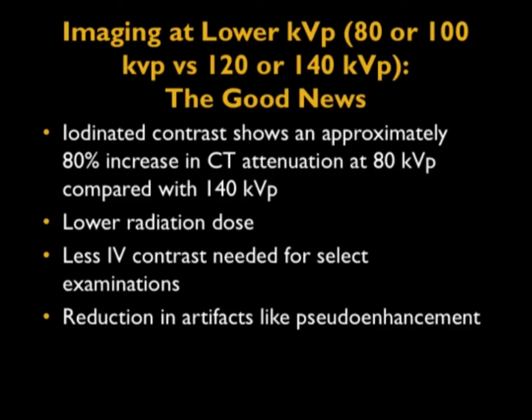You can use less contrast and still get an adequate study because you can make things brighter. That works particularly well in peripheral vessels. In the liver, you need iodine, but in other areas where you're looking at vessels, particularly runoffs, it's not an issue. So you potentially can do lower radiation dose. You can need less contrast. People at RSNA last year showed there were some new scanners that could do literally 25 cc's or so and do an entire runoff. So those things become important.